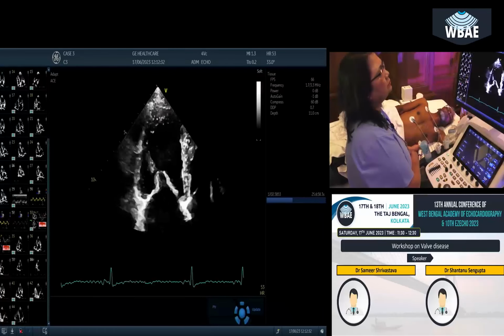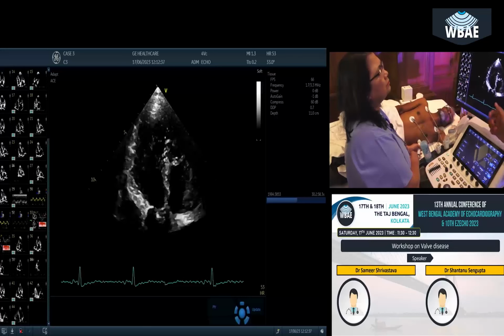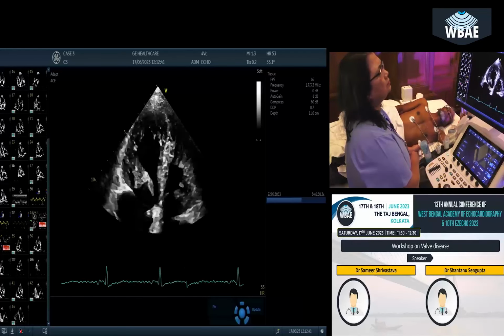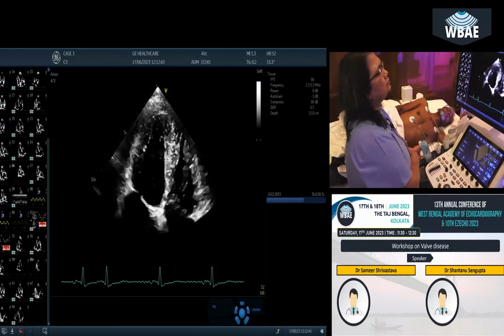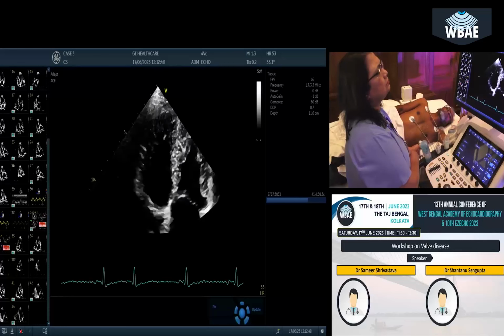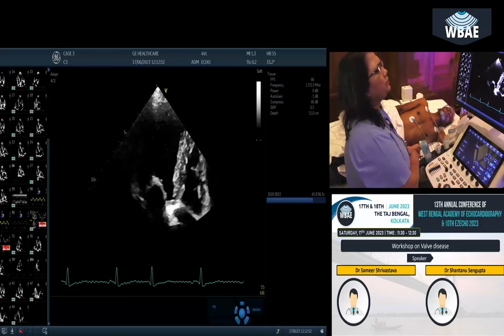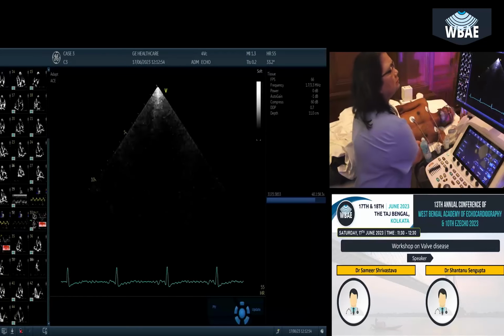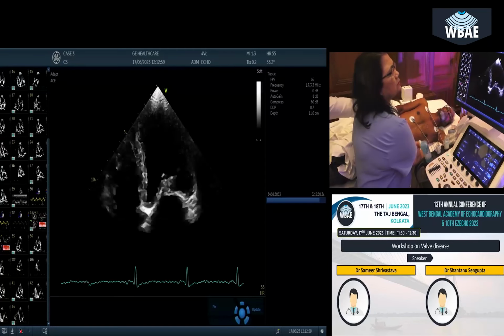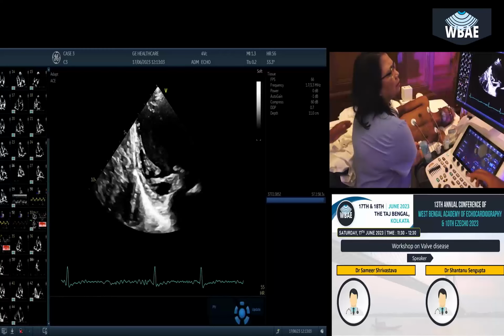How do we do that? If you do LA volume only in 2-chamber view and I do it in 4-chamber, they will be very different. If I do biplane and you do monoplane, they will be different. If you do monoplane for whatever reason, then write that you are reporting LA volume based upon a single plane, which is fair. You didn't have time, but you are telling overall LA volume is increased. This is one of the parameters for diastolic function. So we are going to biplane Simpson quickly.